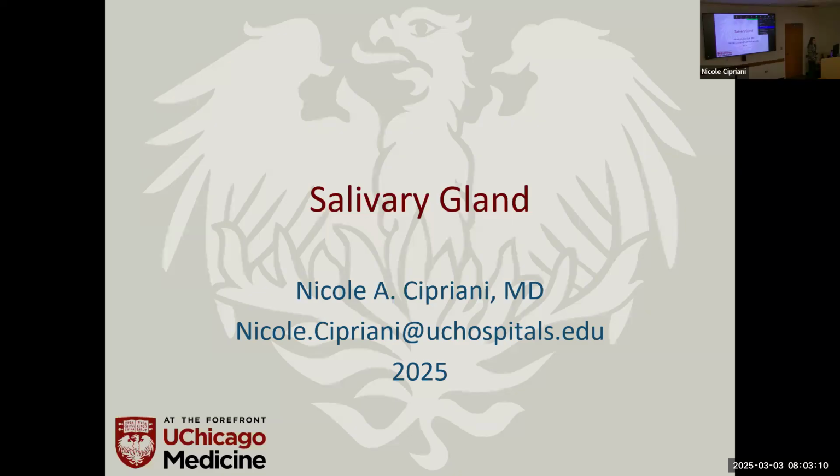All right, so continuing on our theme of glands, we're gonna do salivary gland. And so today will be the didactic, and then Thursday will be the unknowns. And I have them already, so again, I'll just send them out to you in Path Presenter, like right after this. If for some reason I forget, just text me and I'll send them out, but they'll come to you now. Okay.